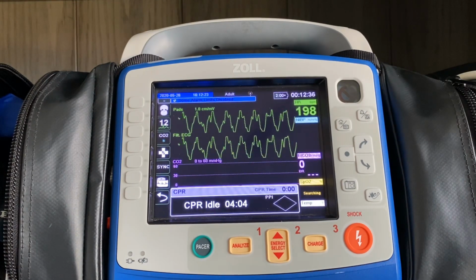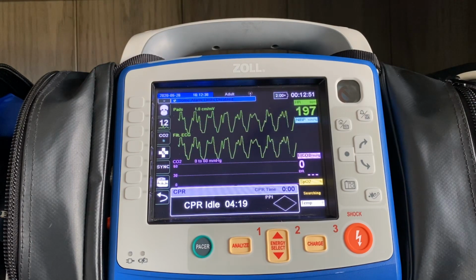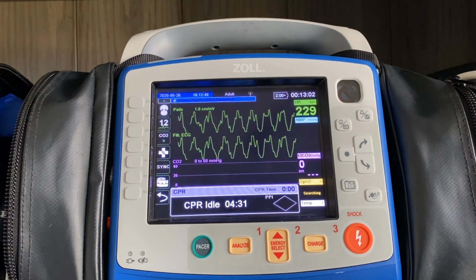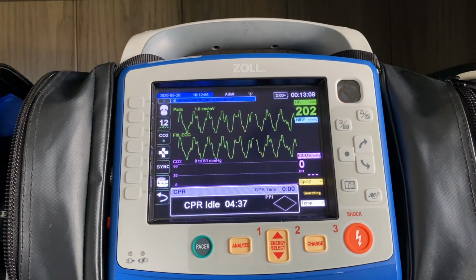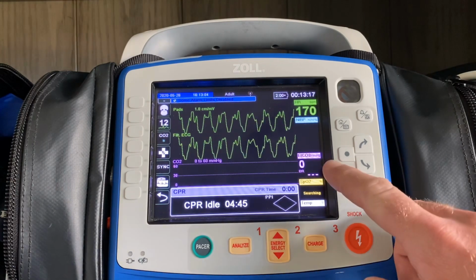All right, so now we understand the functionality of how to use capnography on the X Series. Let's talk about how to maximize its performance during a cardiac arrest call. So the easiest way to think about capnography on a cardiac arrest patient is it's going to be measuring a couple different things. It's going to dictate whether or not that patient has been properly intubated or has a proper advanced airway established. And that's going to be confirmed by whether or not you see a waveform on the screen. So if you're ventilating the patient and you don't see a waveform appear, that's your indication that you have not properly intubated that patient.